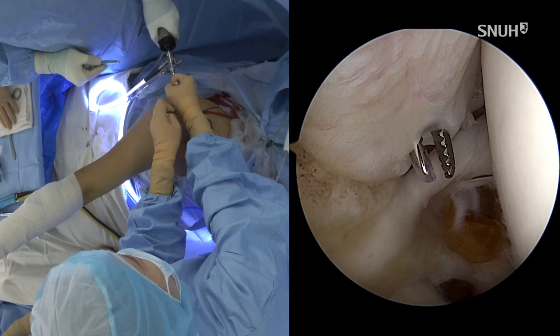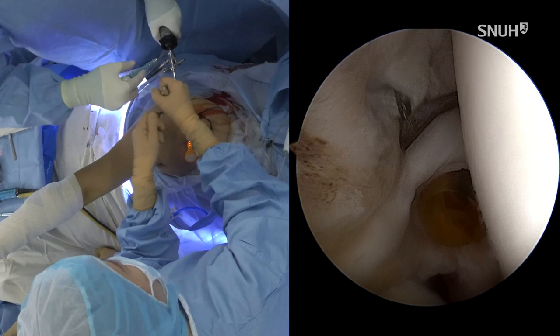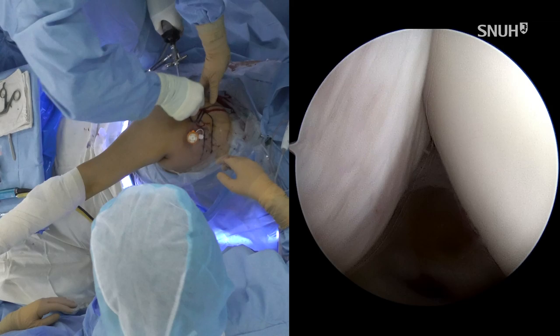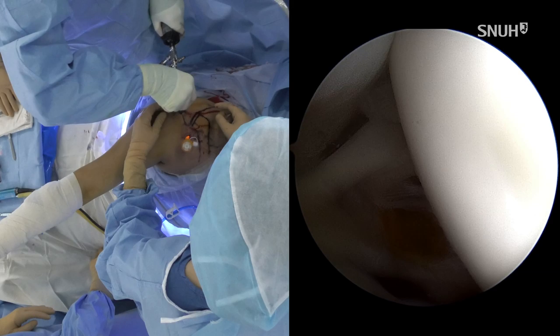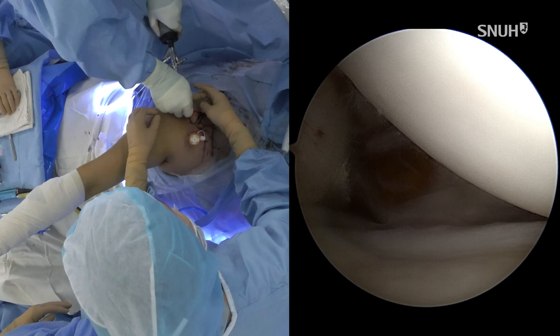Be careful in patients more than 50 years old, but as you know, that's not really an issue. And you can go through that area. Nowadays, probably not many surgeons do SLAP repair for patients more than 50 years old. So go through this portal. That is really useful.